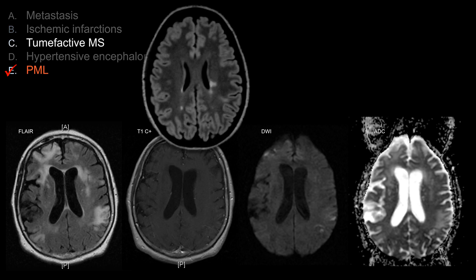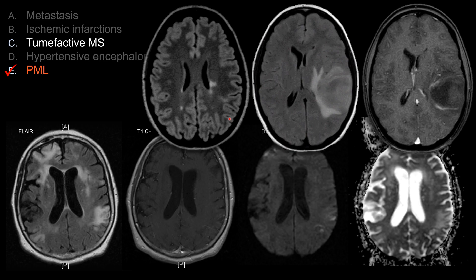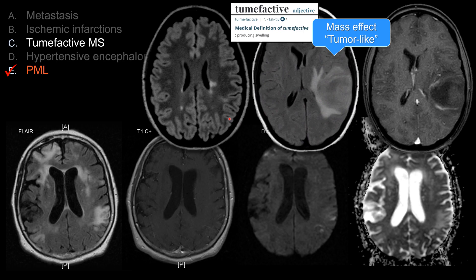For tumefactive MS, this is an example of a patient with MS — notice the Dawson finger lesions as well as some lesions involving the white matter. You can have tumefactive MS, which literally means mass-like, so you will have mass-like, tumor-like demyelinating disease. Sometimes you can have a standalone tumefactive demyelinating lesion. Classically, the enhancement tends to be incomplete rim enhancement or horseshoe enhancement, which distinguishes tumefactive MS from PML.